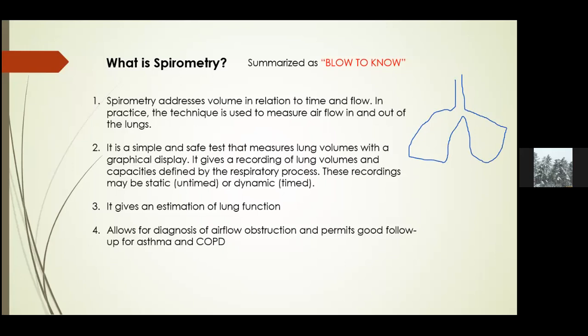When you're just simply taking care of volumes of air, regardless of how much time it takes to move that air, then in that case, you talk of static recording, because it is not taking into account how long you take to move the air.